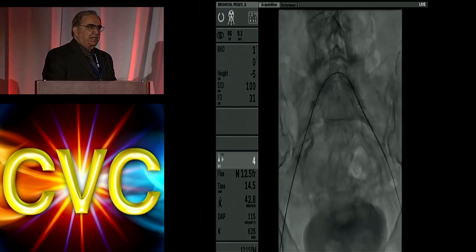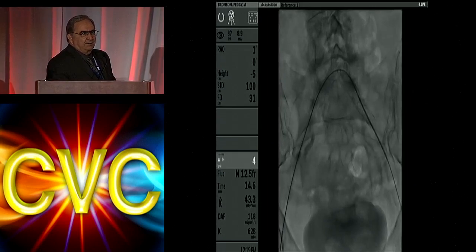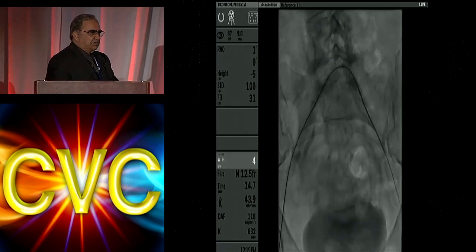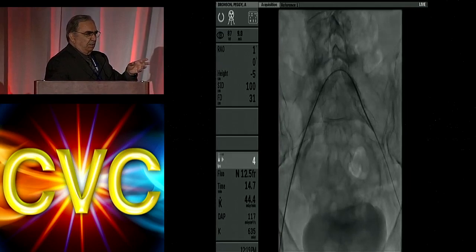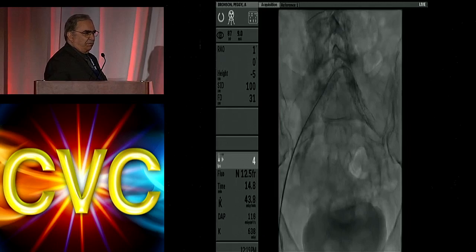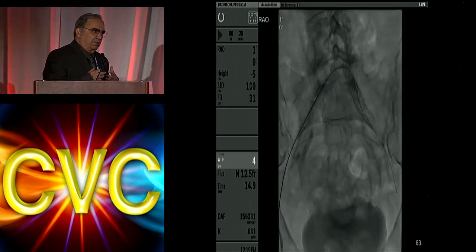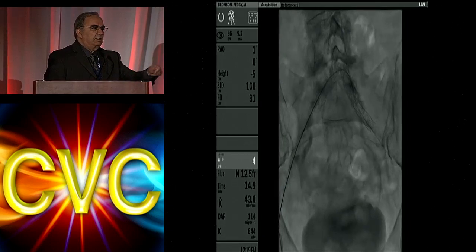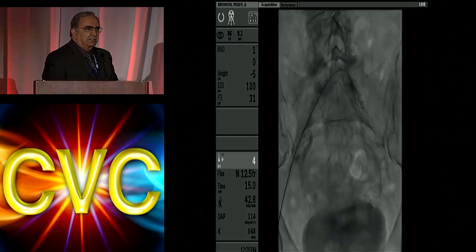It's pretty small down there, but I think the sheath is going to go all the way up to where the kink was. I'm pushing the sheath with the wire out, the catheter over it. The only thing I thought was with those hard curves, entry to the artery was okay. I pushed the sheath against the catheter, then I pulled the catheter out.